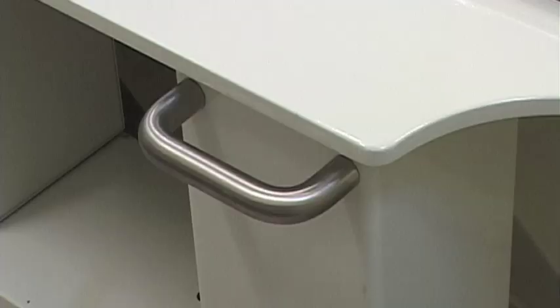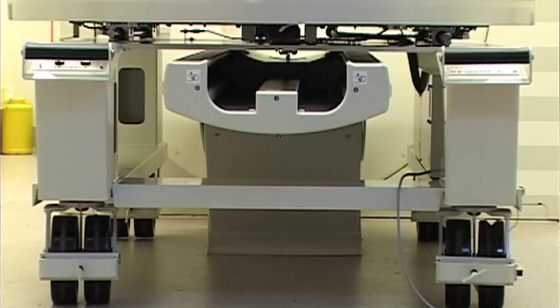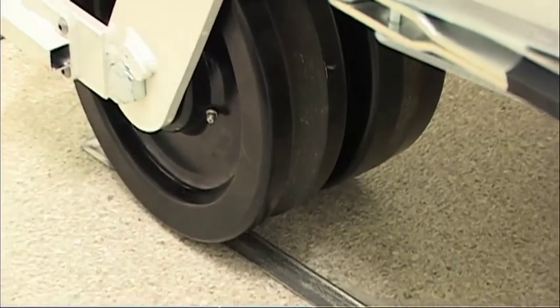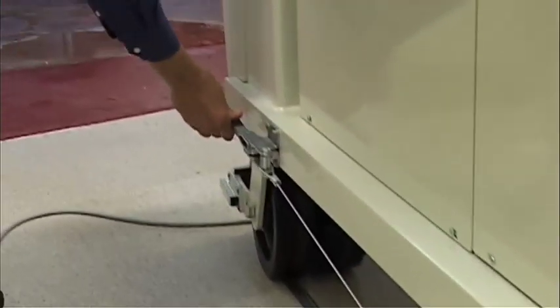The Equus CT has handles that allow it to be positioned directly over the CT couch. It automatically tracks the CT couch without any mechanical or electrical interfacing, moving the selected anatomy into the gantry for scanning. The table is guided into position on a special guide rail fixed to the floor and is locked into position with a cable and lever, ensuring no movement.